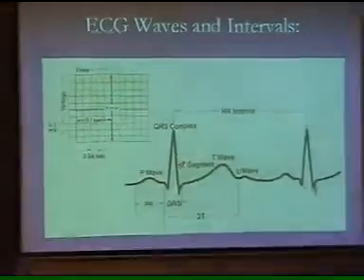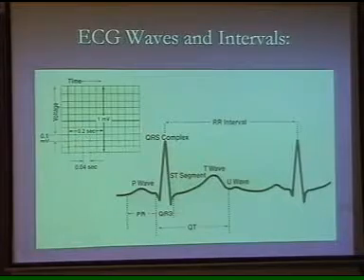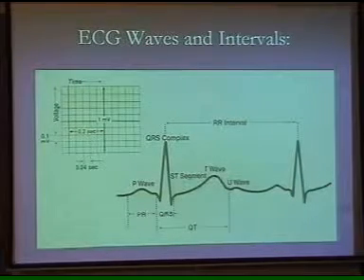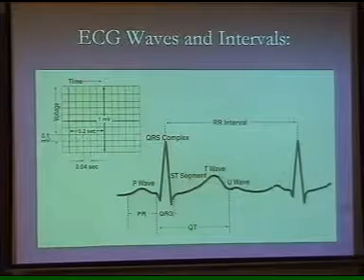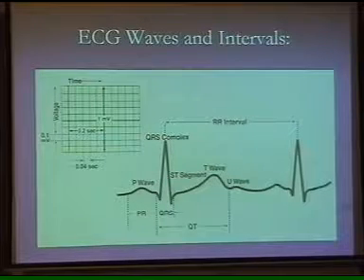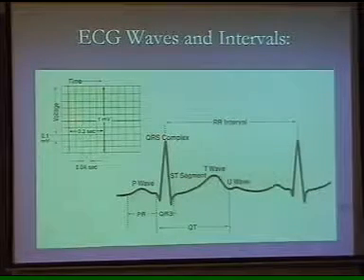So this is the electrocardiogram. Basically, it's just to make it clear that the ECG paper is a grid paper. There's a grid on the ECG. And it is basically run through the machine at a speed of 25 millimeters per second. You can vary that speed, but remember that the ECG paper goes through the machine at a set speed, and the standard speed that is selected is 25 millimeters per second. So in 1 second, it will go through 25 small squares.